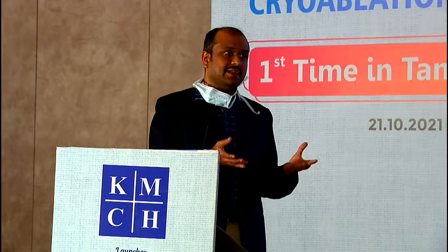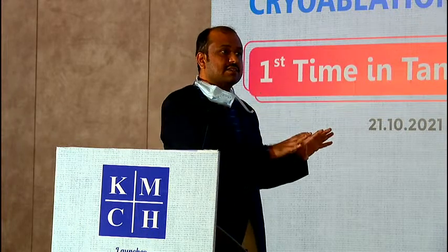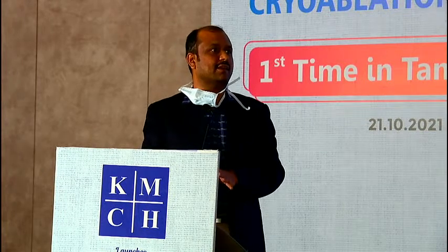Always, like any cath lab procedure, we know very well the more you stay in, the higher the chances you develop a complication. So you stay lesser in the left atrium, short procedure time, safer, and results are as good as radiofrequency ablation. The non-inferiority trials have clearly shown that cryoablation is as good as radiofrequency ablation efficacy-wise, while all the complications are lesser with cryoablation when compared with radiofrequency.